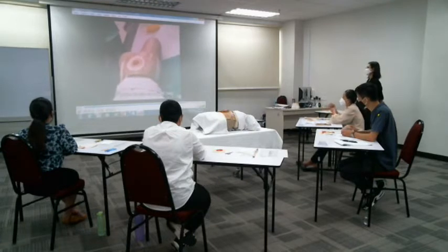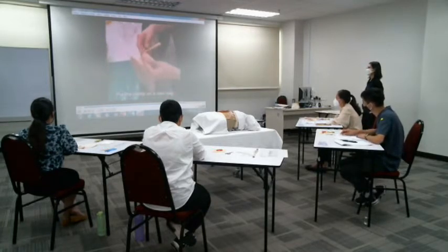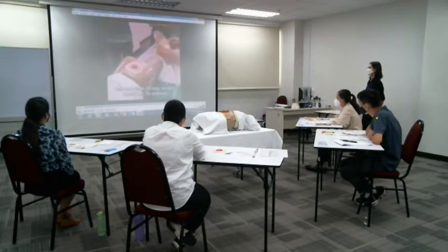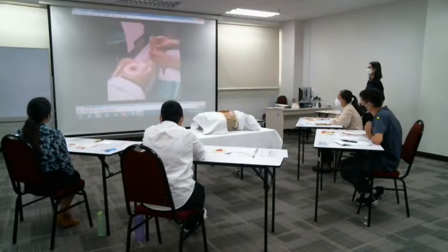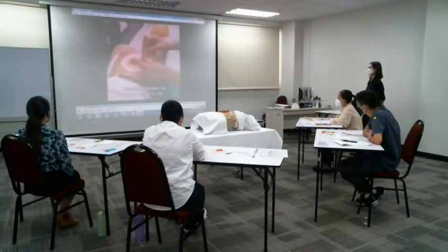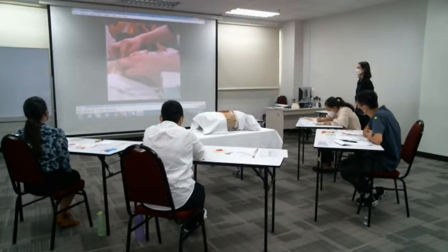Let's take a deep breath. Then I clench first. Clench. Okay. Then now I have to decide: if my patient is able to walk, then I will put it upright. If my patient is bedridden, then I will put it sideways. Okay? And so I will fix from bottom to top. Right? So now I ask Madam Susie, can you please harden your abdomen? Harden. So it's easier for you to fix from the bottom and slowly cover until the top.